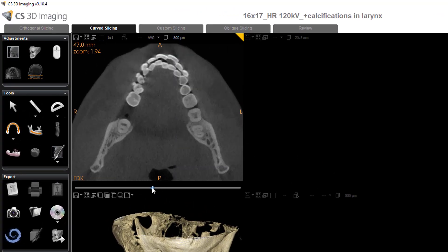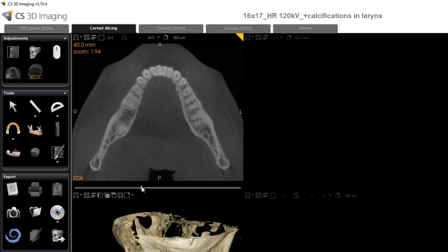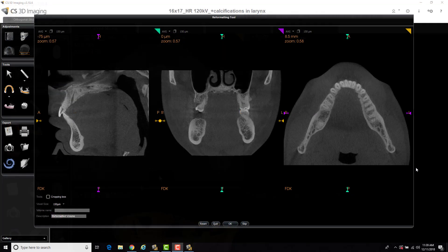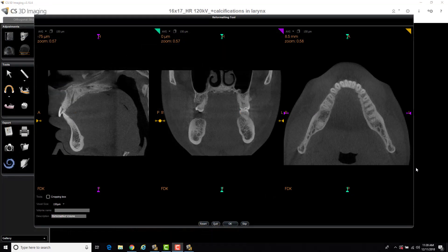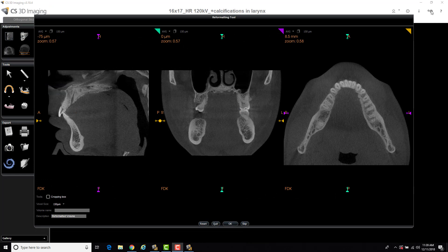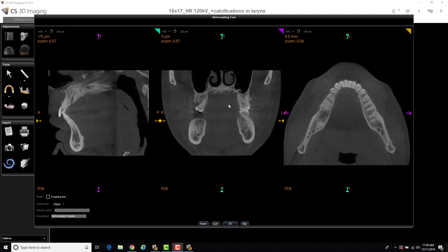And you can use in those software applications that require that. So one last thing to note that under my preferences where I have selected that 9600 checkbox, every time I open a 9600 scan, it's going to go to this reformatting tool. If I wanted to do that and just skip this step, I'm just going to say skip. And it will open the scan up normally. So if I wanted to remove this particular step each time I open a 9600 scan, I'll go back into my preferences and deselect that checkbox, or just simply hit skip each time. Hope this helps.